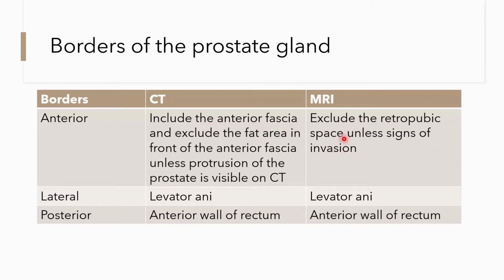So we generally look at the MRI, we find out which regions have the prostate cancer, we read the MRI report, we see whether there's any extracapsular extension, we see whether there's seminal vesicle involvement on the MRI. So if those are not involved, if there's no anterior extension, we leave that anterior extension out.